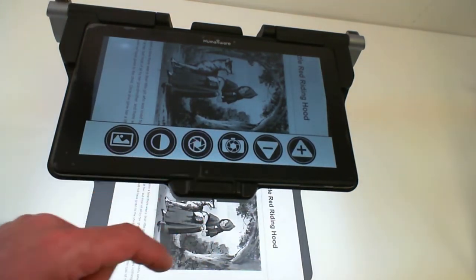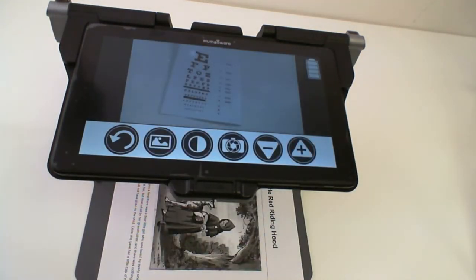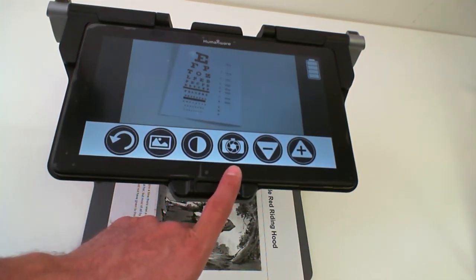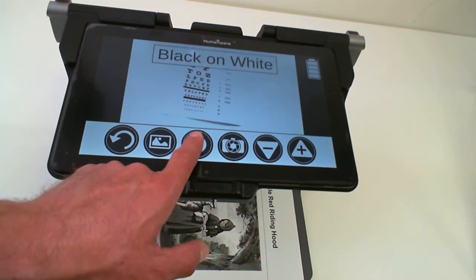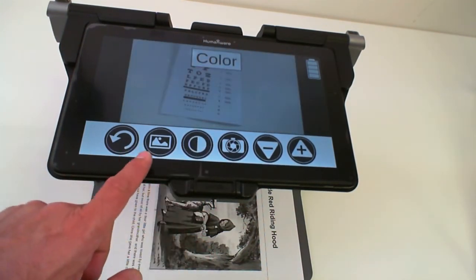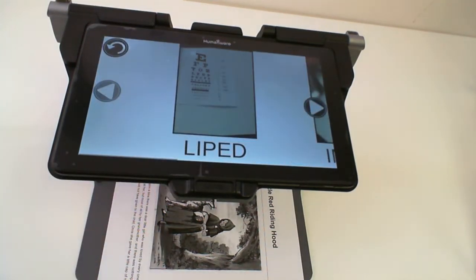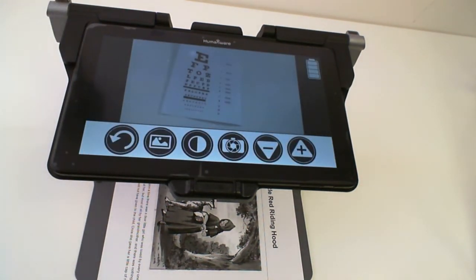The third button is my Distance application button. If I click on that, this will bring me to my Distance application to use my Distance camera. Once my Distance camera is activated and connected, I can take a capture — the OCR will be done automatically on that capture. I can change the magnification levels and contrast colors, and I also have the option of going into my Gallery with the Gallery application button.